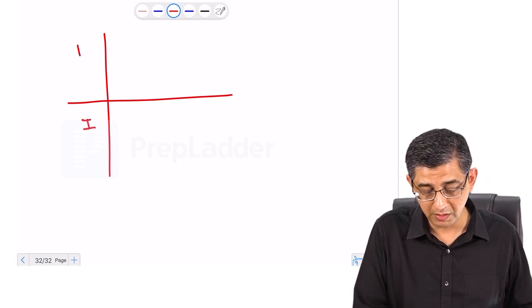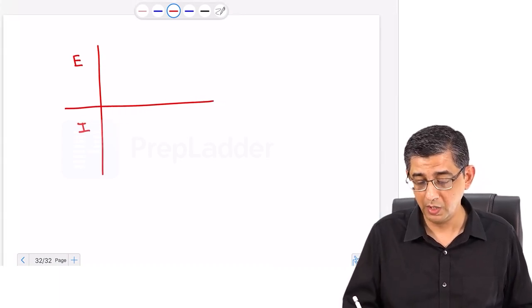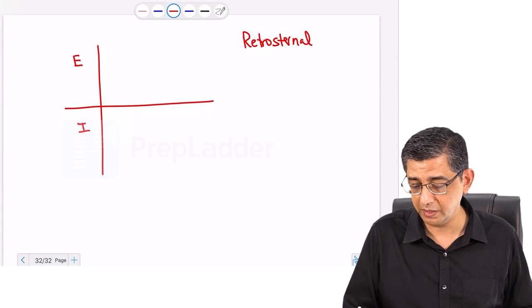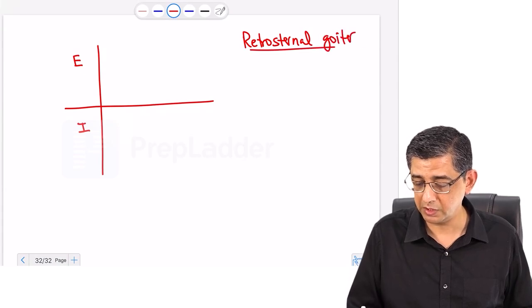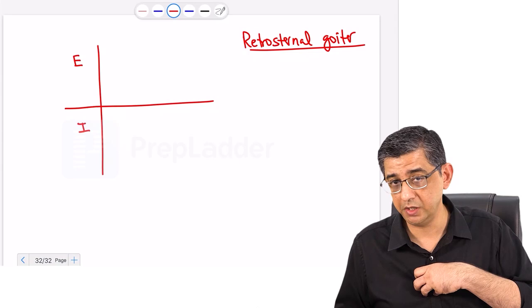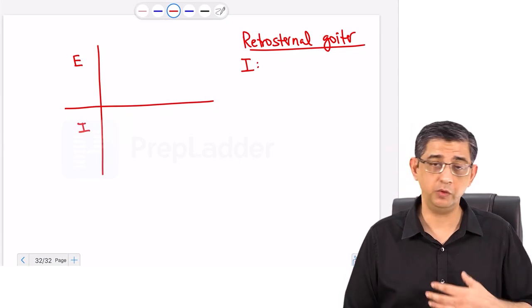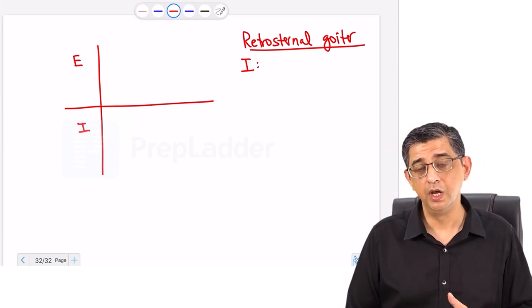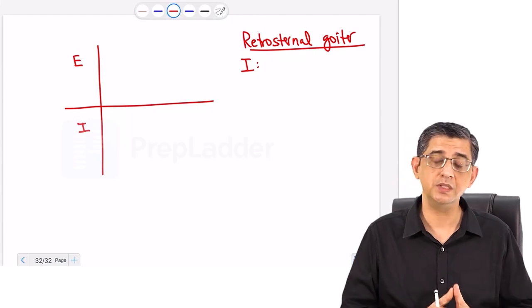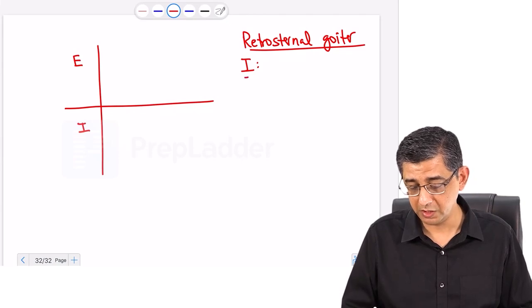I will first mention the disease. In fact, if I start with the curve and then go to the disease, it will become difficult for you to comprehend. So at the moment, I'm mentioning the disease to you right away, and then subsequently I will explain how the flow volume curve in this person will change. So imagine a person having a big goiter, so big that it has a retrosternal extension into the chest. When a person with a retrosternal goiter takes in a deep breath, there would be negative pressure in the chest on inspiration. So there will be a downward movement of the goiter and it will press on the airways. The message is, in a patient of retrosternal goiter, there will be an effect during inspiration, because inspiration will generate negative force.